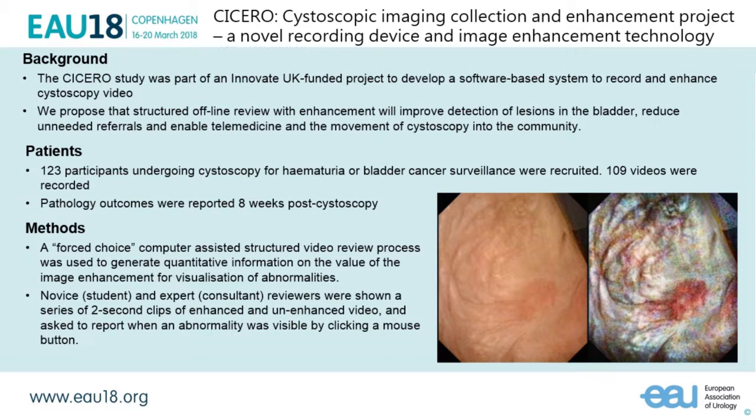So there are limitations to what we can see, what the camera captures. Those limitations are because there are biophysical limitations to the eye, and also because there are neurophysiological limitations to image perception. However, there's much more that's captured by the camera, and there are some very simple image enhancements that could be made to standard video capture.